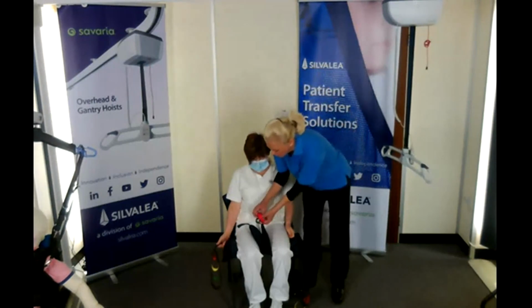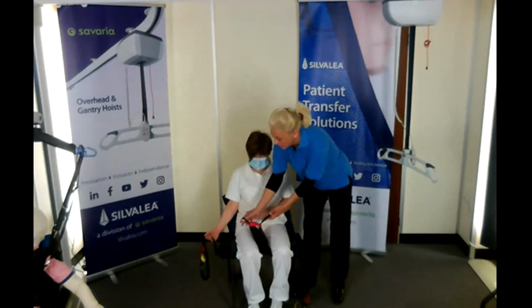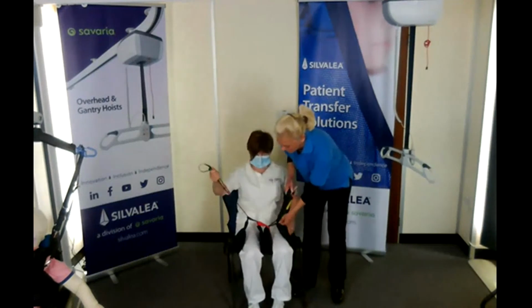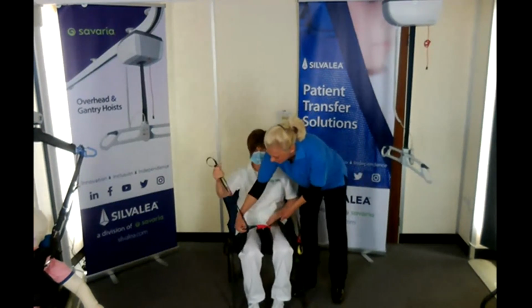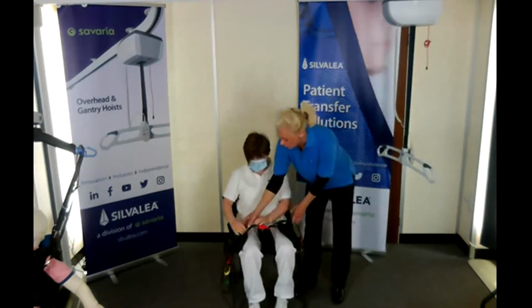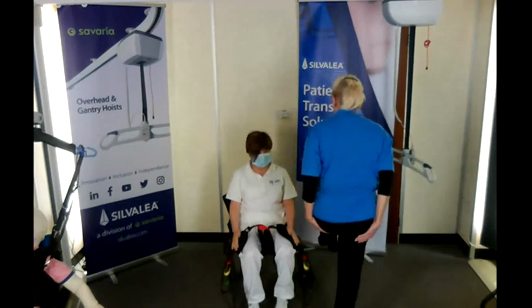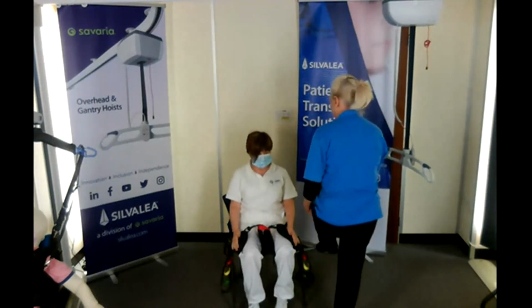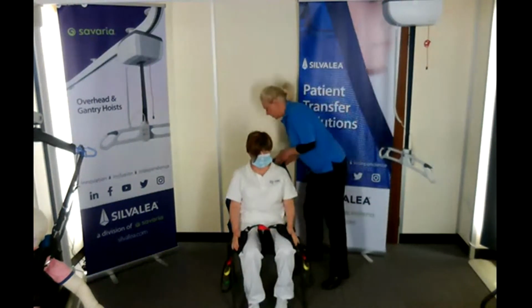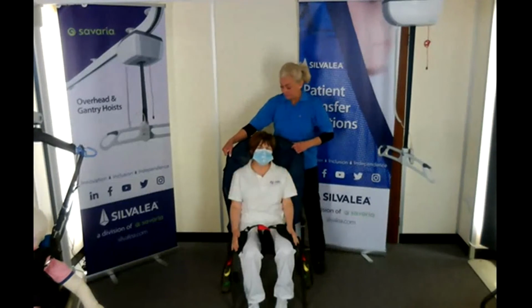And then we've got a red modesty that connects the legs together, and then you feed the tape from the outside through. So that is the leg section. But it's important, even if you're putting it on the bed, to make sure that you've got the lower half in place. The sling comes around, you've got the bottom support and the legs fully supported. Don't worry about the top section initially. This will sort itself out when we hoist.